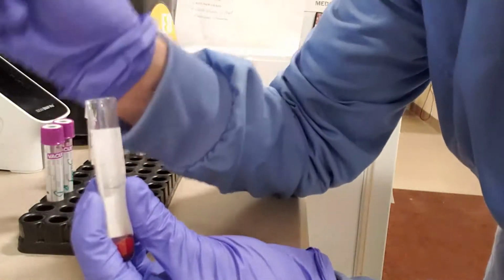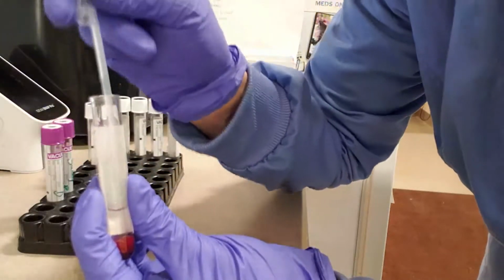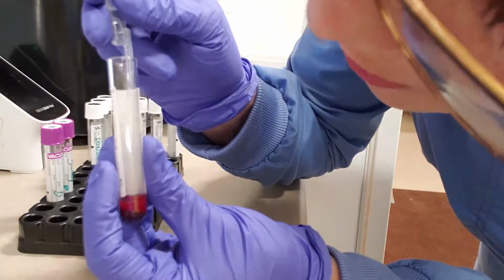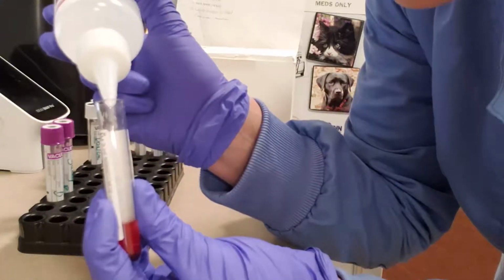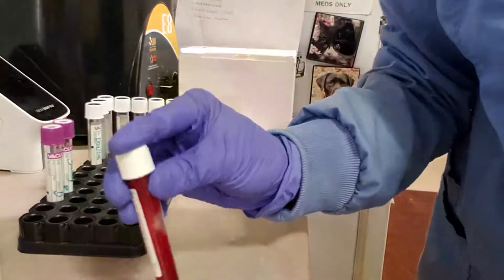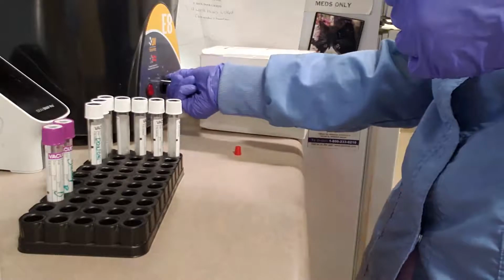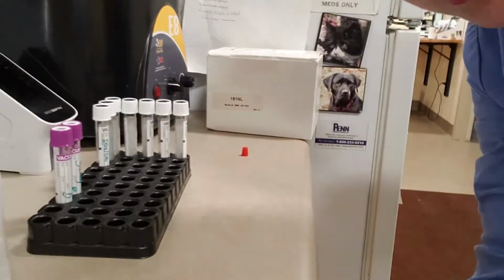Okay. Put our dirty saline into our cup. Okay, and again, you want to be very careful not to disturb our packed red blood cells. And we will add our saline for our final wash. Make sure that they're all set. Okay. Put it down to our timer, and then we'll be ready to move on to our next step once we finish washing our red blood cells.